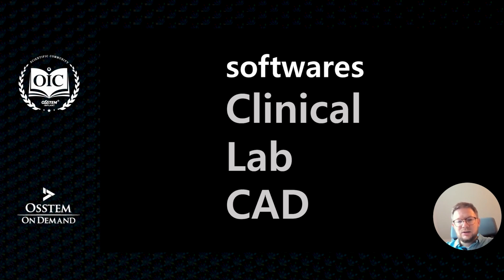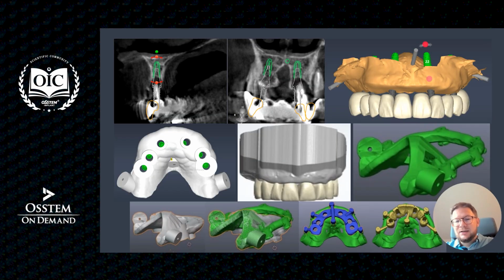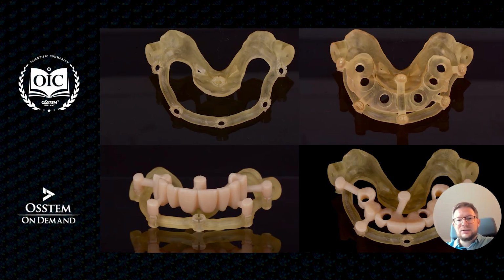So for more complex cases, not only clinical but also lab and CAD software could be needed, and then cooperation with a team of dental technicians or a CAD designer could be required, but that is more complex and requires additional software.